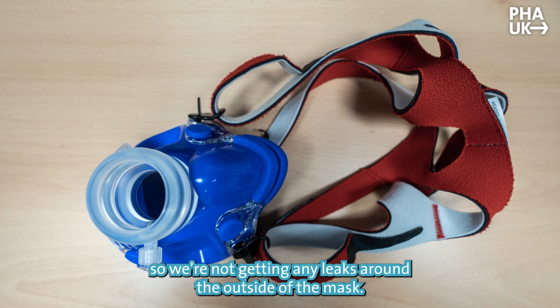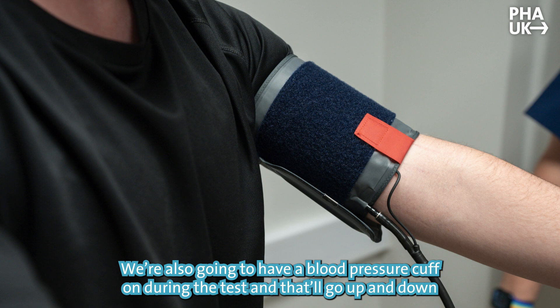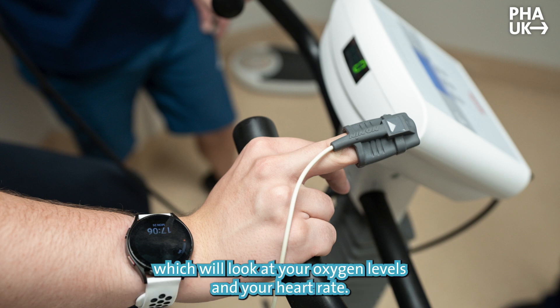The mask has to be fairly tight so we're not getting any leaks around the outside. You're also going to have a blood pressure cuff on during the test, and that will go up and down quite a few times during the exercise. Finally, you'll have a little finger probe on, which will look at your oxygen levels and your heart rate.